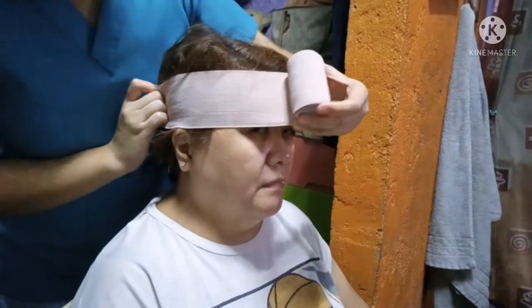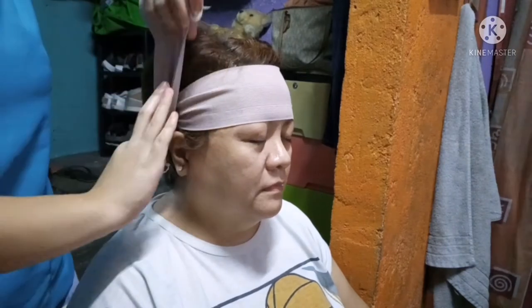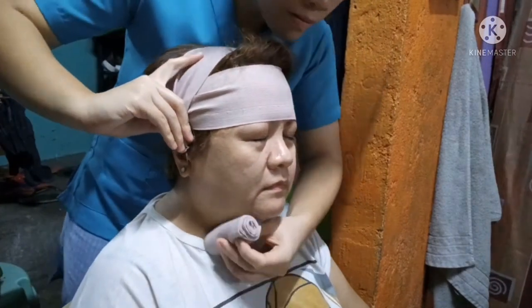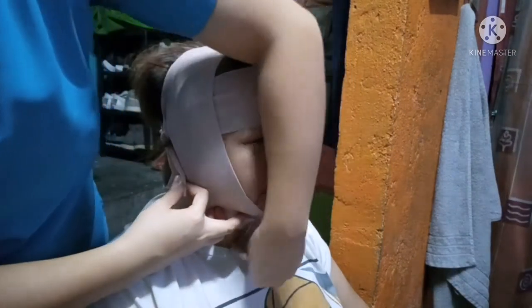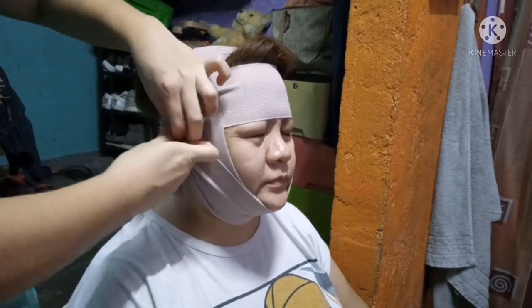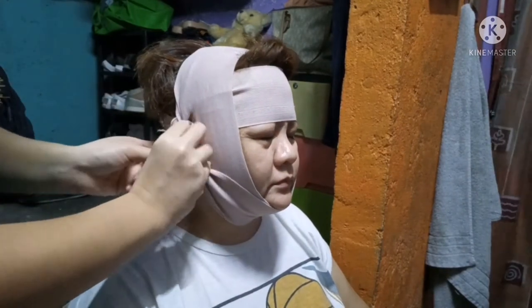Using a roller bandage, roll the bandage on the anchoring side first. Anchoring is used for wounds on top of the head, side of the head, ears, cheek, or chin — anchoring is around the forehead and back of the head. The first loose end should be left untucked; ask the victim or another rescuer to hold it. Roll the bandage in two rounds around the forehead and back of the head, then cross the bandage on the first loose end. Continue by bandaging on the pressure pad on top of the head and through the chin. Finish up the roller bandage by tying the end together with the first end.